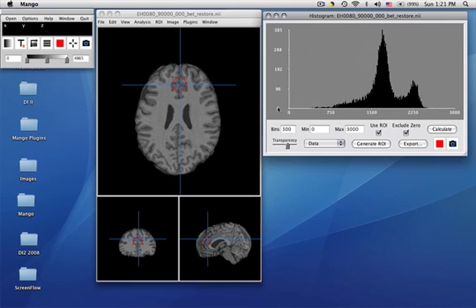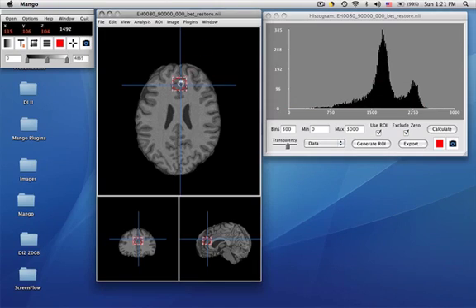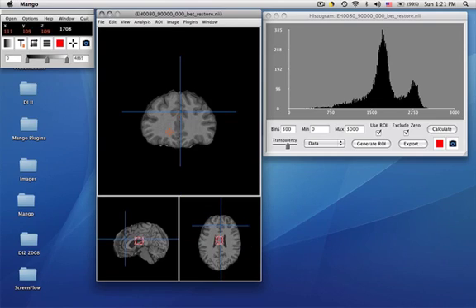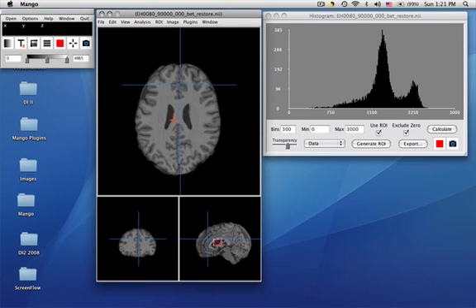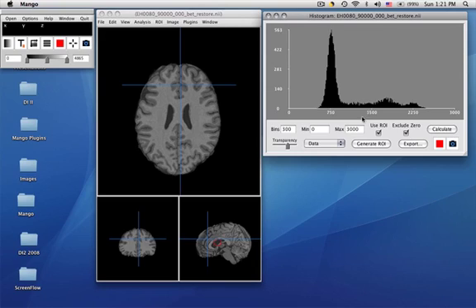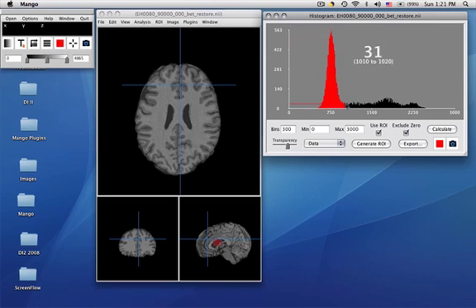So if I move the ROI down into this range, if we wanted to sort of center it over ventricles, we might take a look at how to do this better and look to see what we've got here and calculate. Now we see that the distribution is heavily weighted towards CSF.